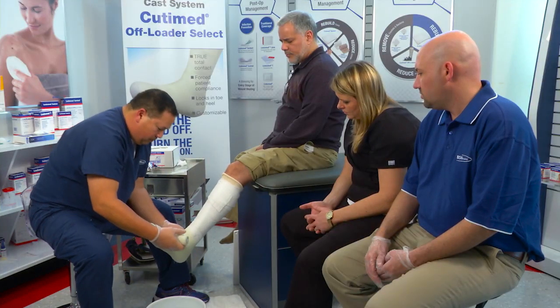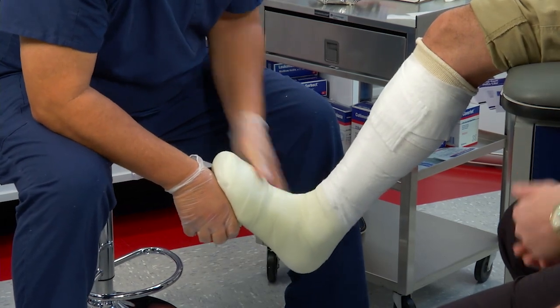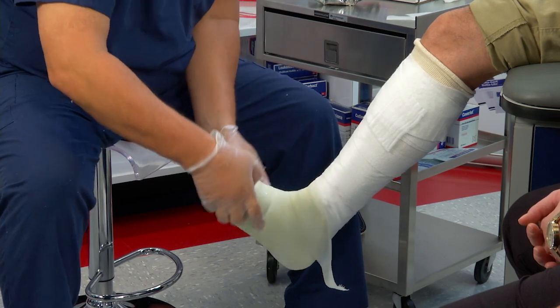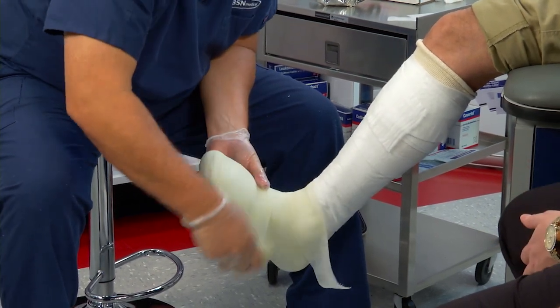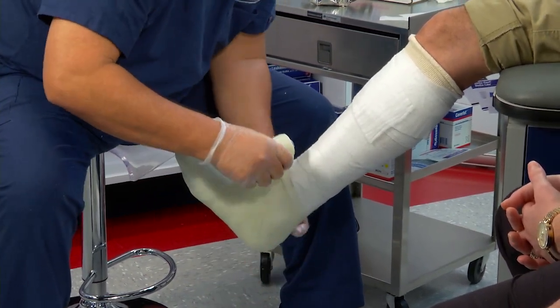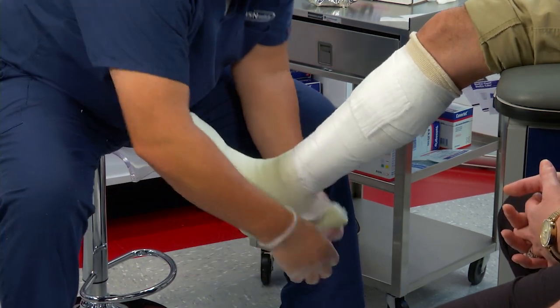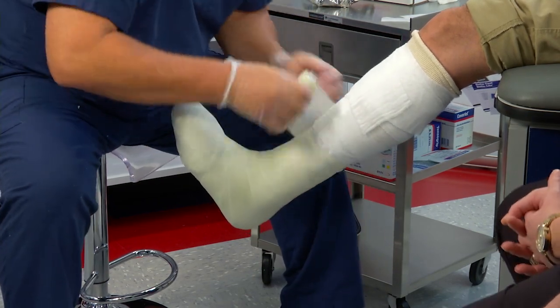I'm going to start this one at the base at the metatarsal head, right here, so I don't catch a dog ear. I want to come around 50% overlap — I can catch that little tail when I come around again. No figure eight, right around the ankle, going 50% overlap.